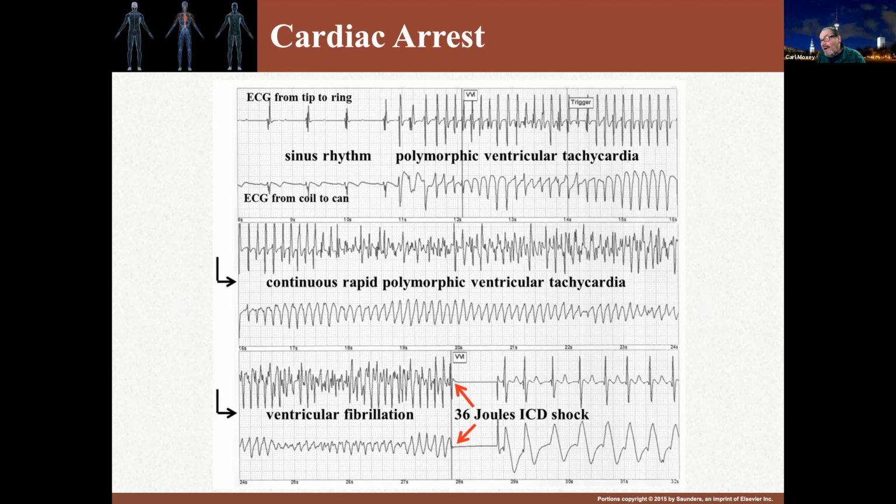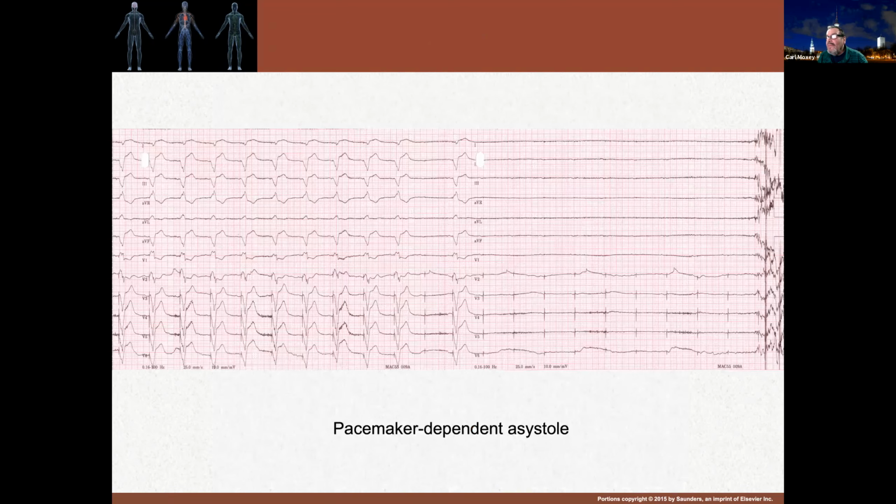And you notice that put everybody into absolute refractory period. And then we restored a rhythm. It's not a great looking rhythm, but it's a pretty good rhythm.